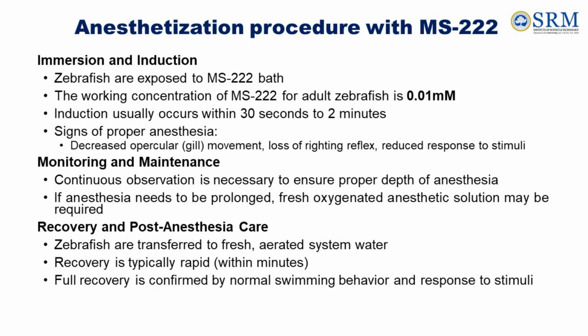Anesthetization procedure with MS-222 involves three major steps: immersion and induction with the chemical anesthetic, monitoring and maintenance of the experimental zebrafish, recovery and post-anesthesia care for the experimental zebrafish. Let us look at the first step, immersion and induction.